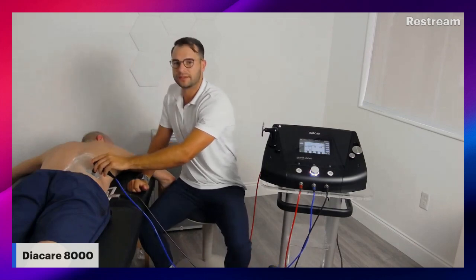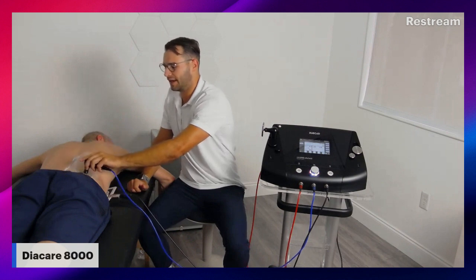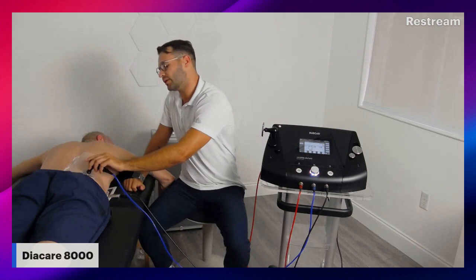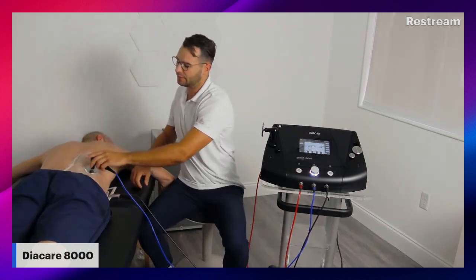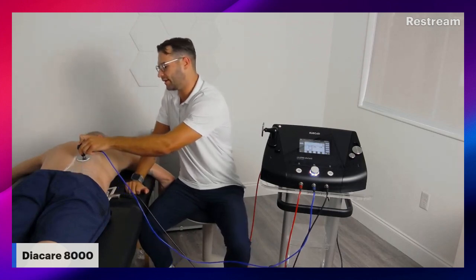We also have the ability to use a hands-free kit. So therefore, we can almost use it as if there are sticky pads of electrodes, and it's going to generate the same kind of treatment. However, you can have the patient going through exercises or mobility on their own. You don't have to stand there and treat the patient.